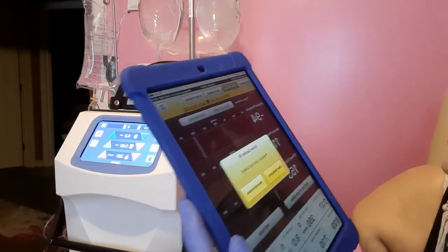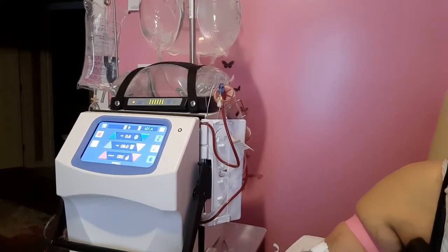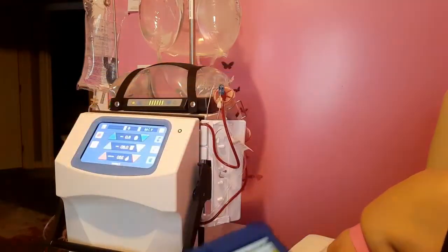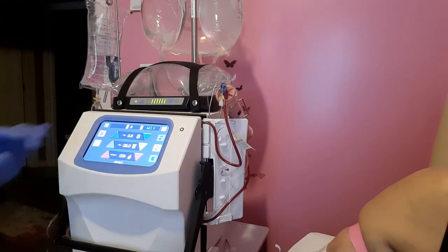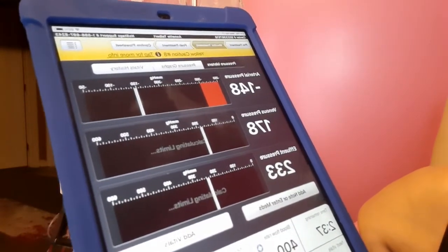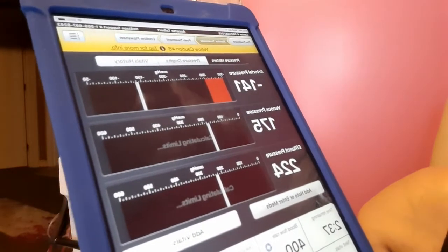All right. Hold on a second. Get rid of that. Okay. Still looking good. Under 50%. Go to 400. Pressure still under 50% because half of 400 is 200, and that's well under 200.